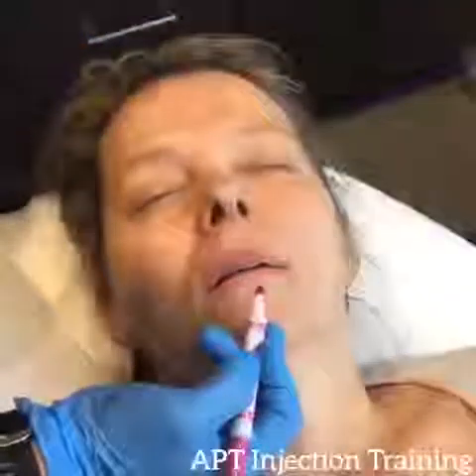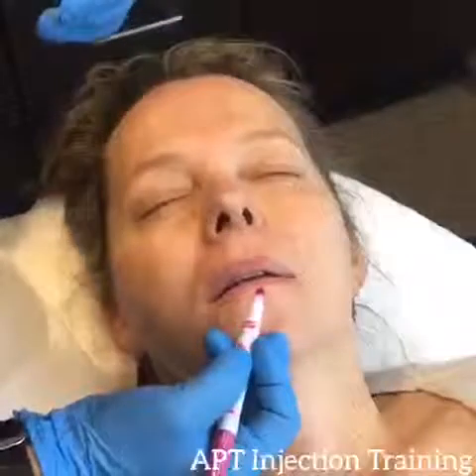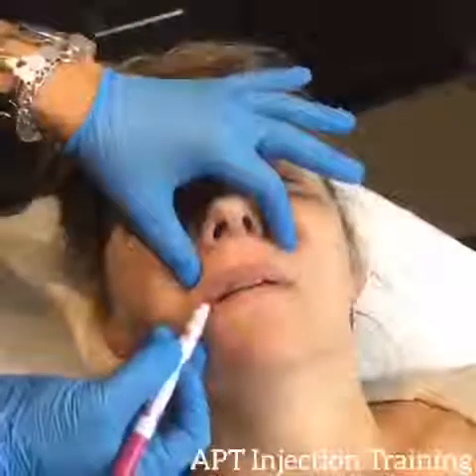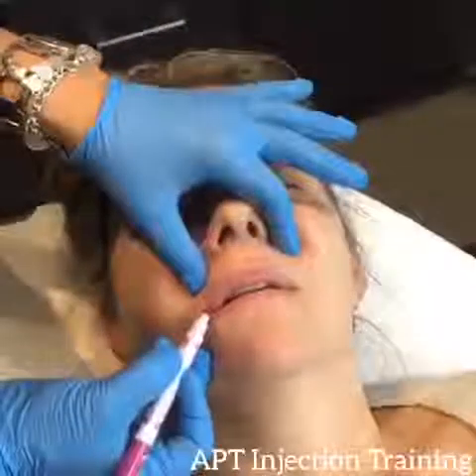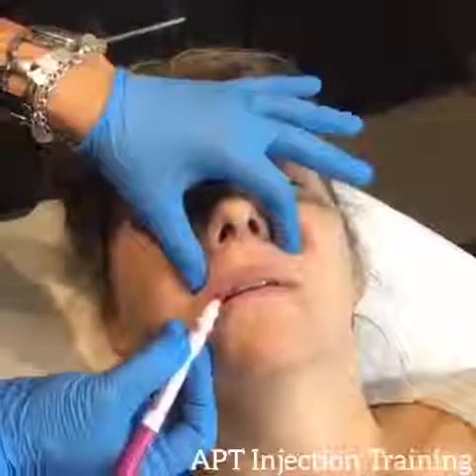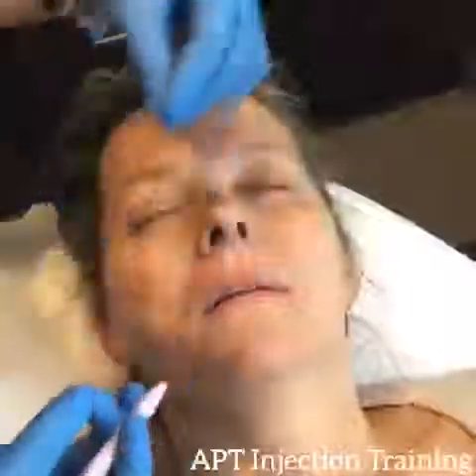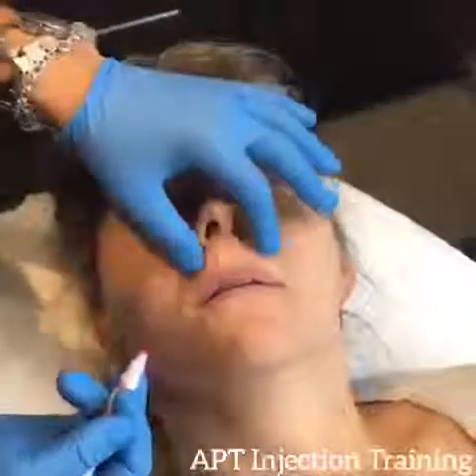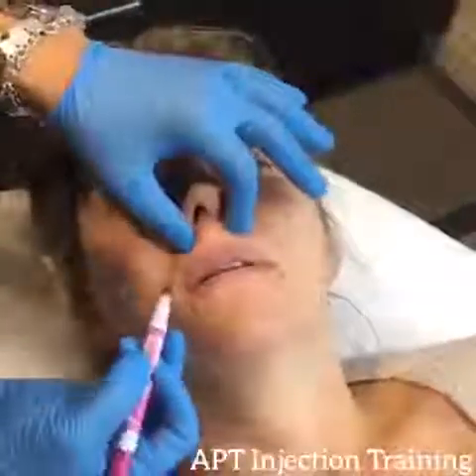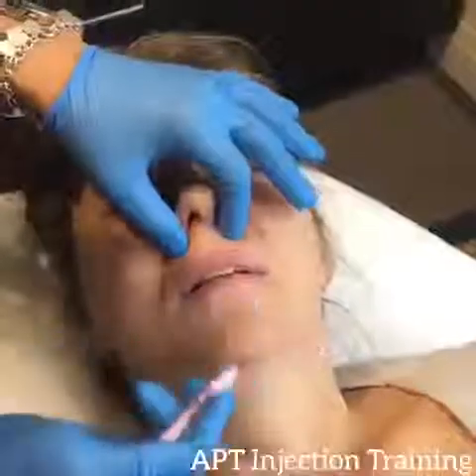So it's a very dangerous area to inject, because if you get into that artery, especially if you're inserting your needle in this orientation, the path of least resistance is along the lumen, and you're going to fill the artery as you do a retrograde injection and cause an occlusion of the lip. So we want to stay away from being posterior to the wet-dry.